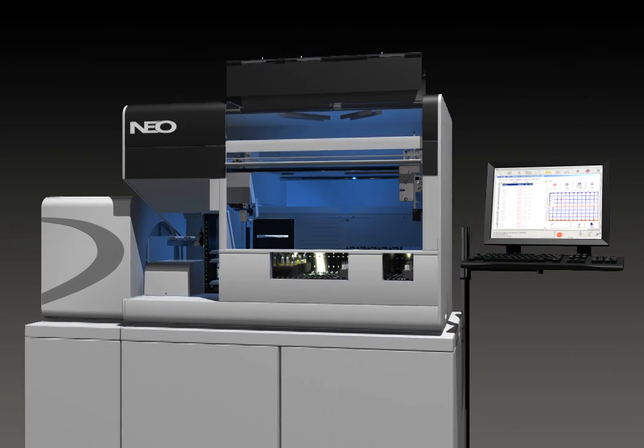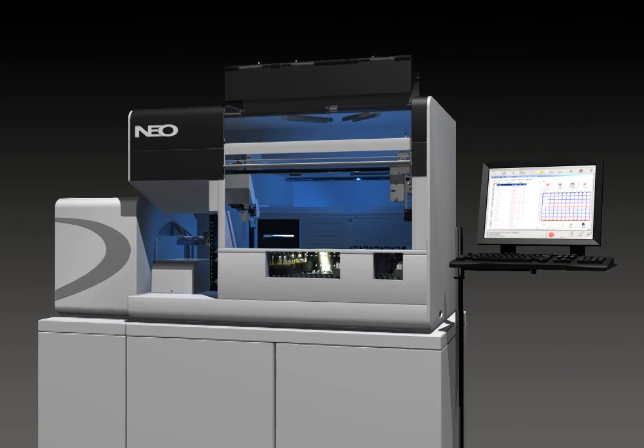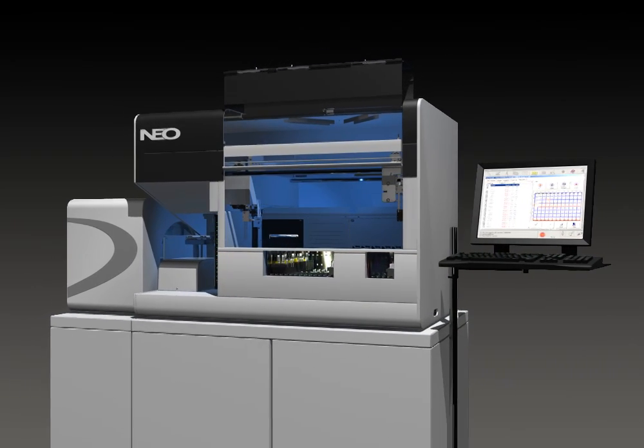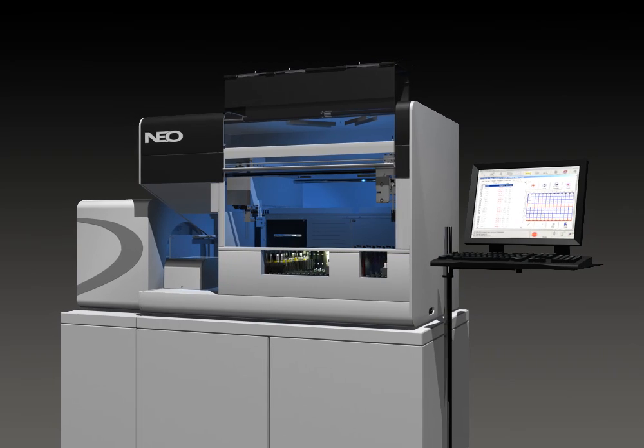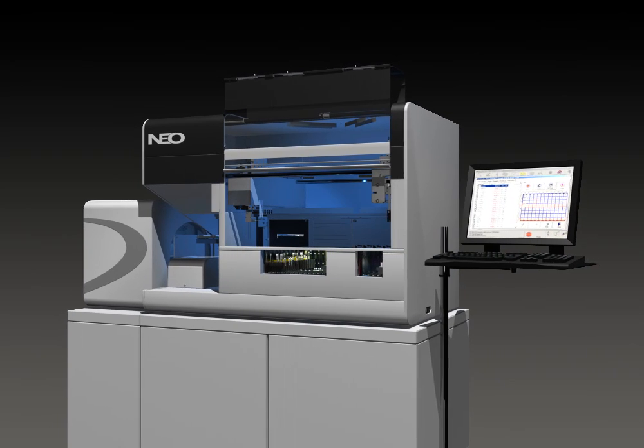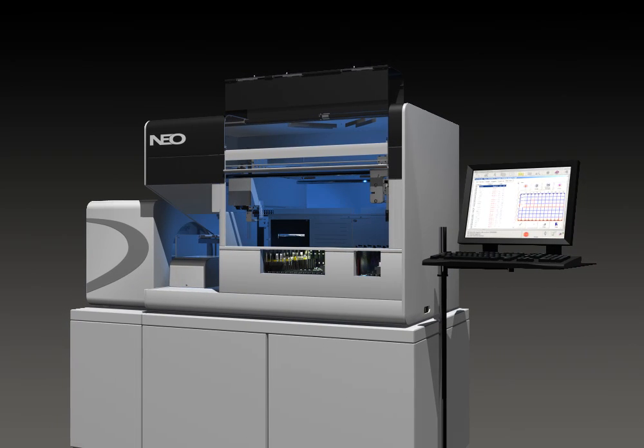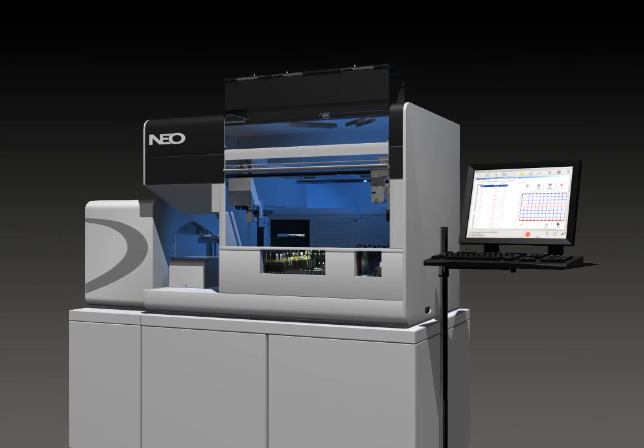NEO gives your laboratory the ability to achieve exceptional performance power, enhance speed and unprecedented flexibility.